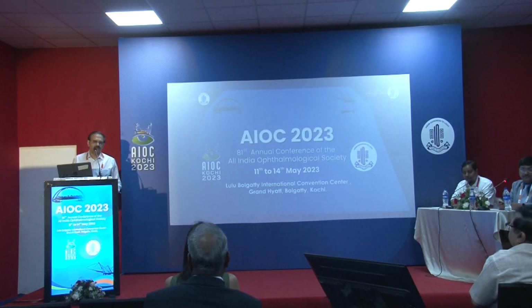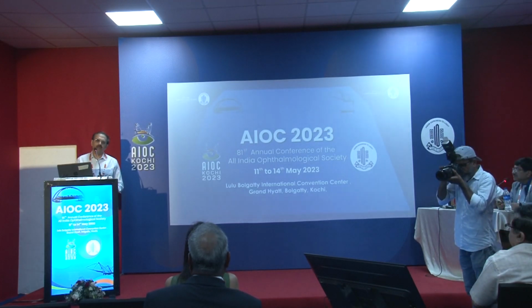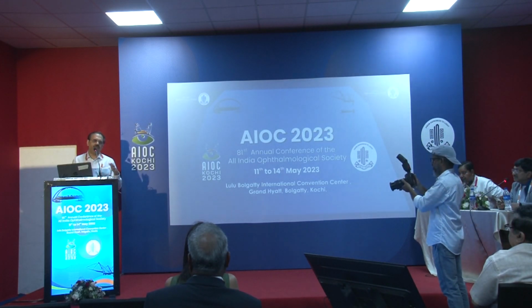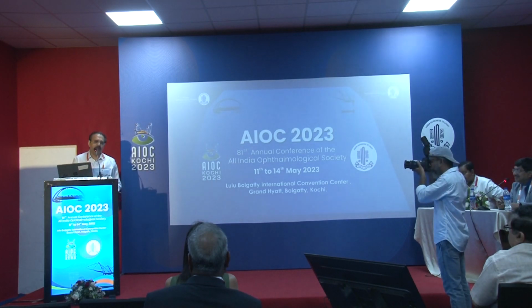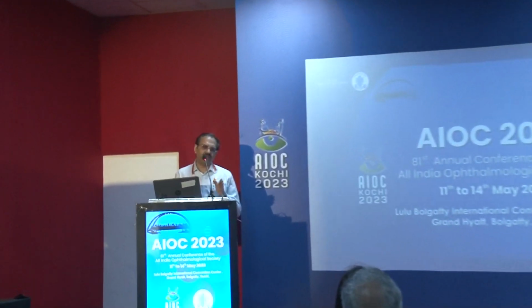Also, a question to you: there are a very few patients who persistently keep complaining about halos and are unhappy. In your experience, have you had to explant and do an IOL exchange, or how do you deal with those patients? Ma'am, honestly speaking, I have only explanted the lenses of other doctors, because there I am a little aggressive, thinking okay, let's take it out. But whenever it is my patient, I have always been conservative, and 100% I have seen that if I have given time to the patient, as long as 3 months, or even made them wait up to 6 months, and if they have stuck to me, they all get settled gradually.